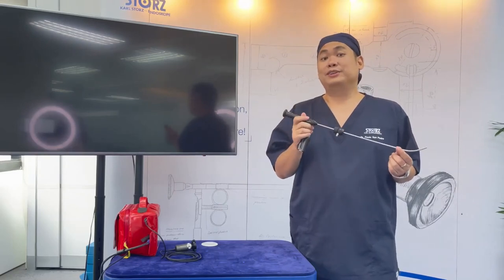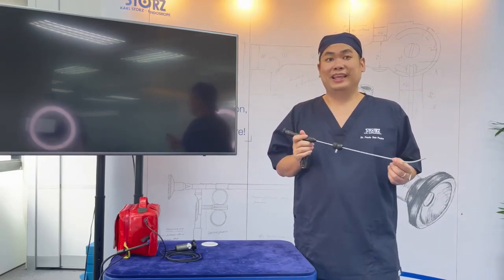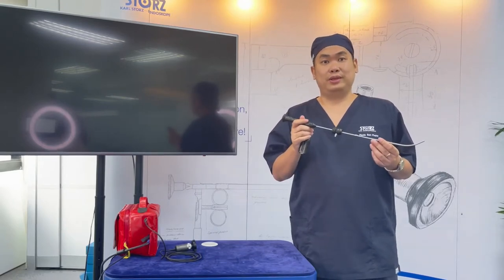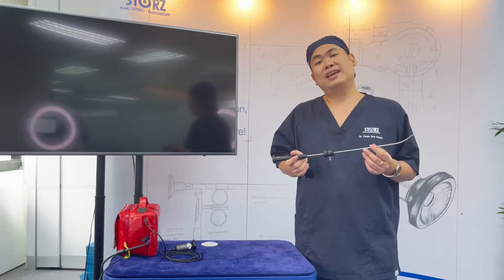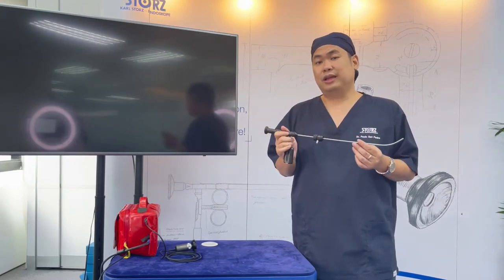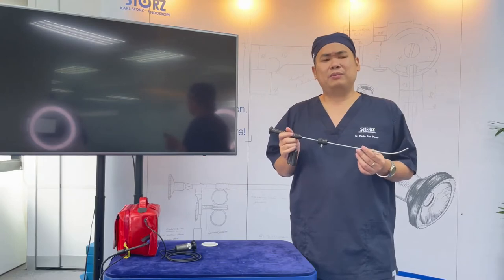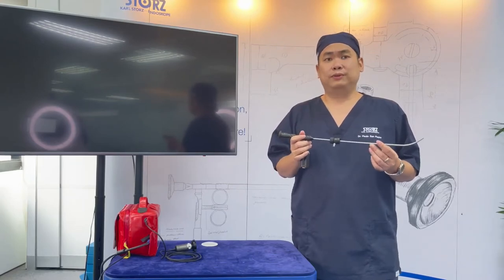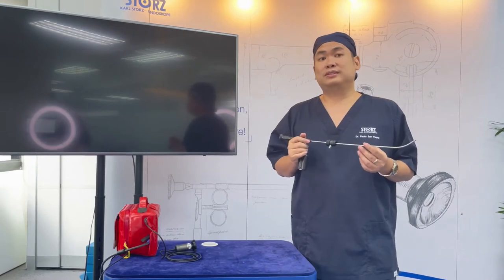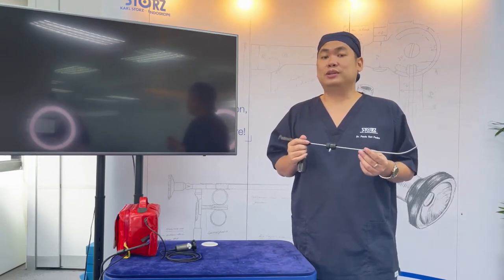The Bonefills is my favorite device for airway management. It is very effective and very reliable, especially in rescue airway. The best part is it is very durable. I'm using this one for teaching and I cannot remember how many times someone has dropped this on the floor. This video will discuss the step-by-step approach in using the Bonefills.